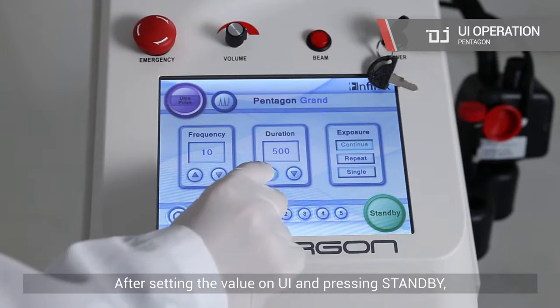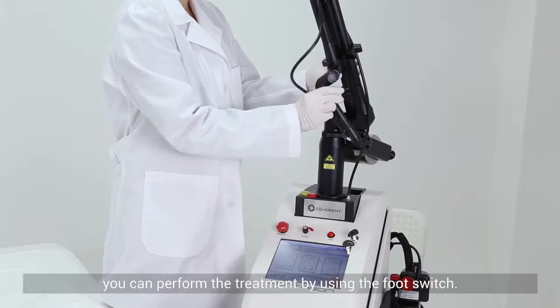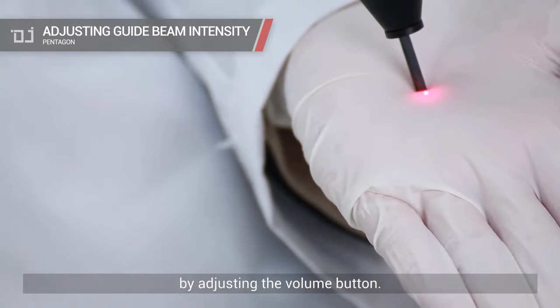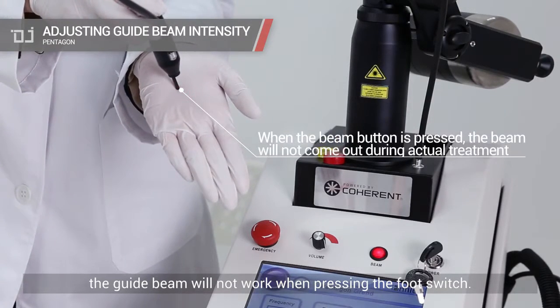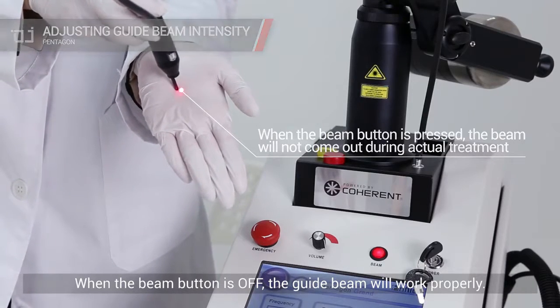After setting the value on the UI and pressing standby, you can perform the treatment by using the foot switch. You can control the brightness of the guide beam by adjusting the volume button. When the beam button is on, the guide beam will not work when pressing the foot switch. When the beam button is off, the guide beam will work properly.